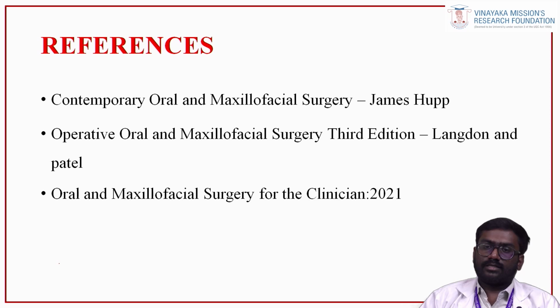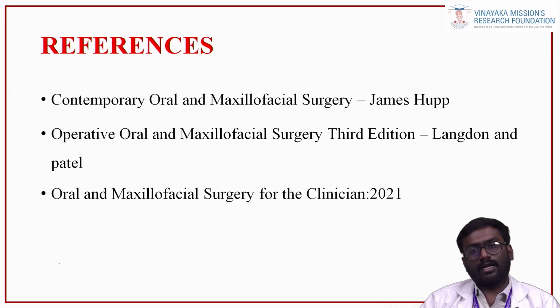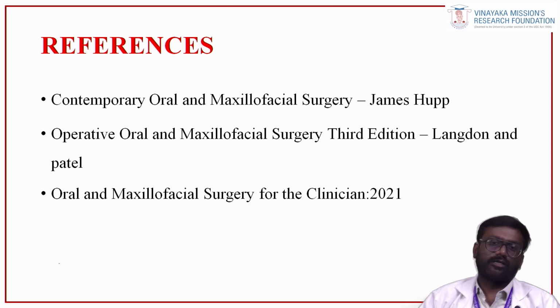Next, once that is done, go for root end resection. There we have to keep three things in mind: the instruments that are used, the amount of resection, whether it is 1 to 3 millimeters based upon ramifications and lateral canals, and the bevel. It is now 0 to 10 degree bevel, keeping in mind to conserve the root structure to have an adequate crown-root ratio. Once all this is done, you inspect whether you have left anything behind, by using certain dyes, and you can monitor it.